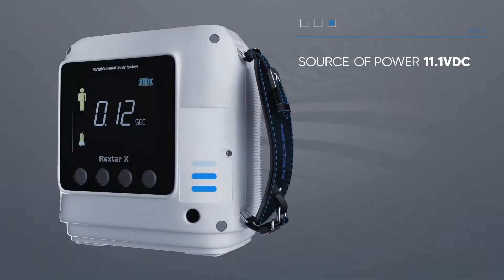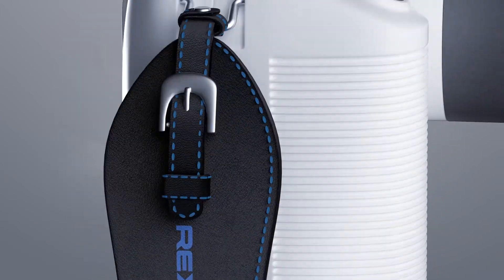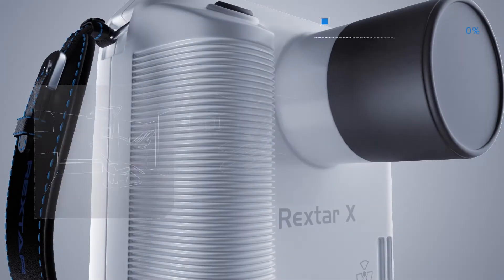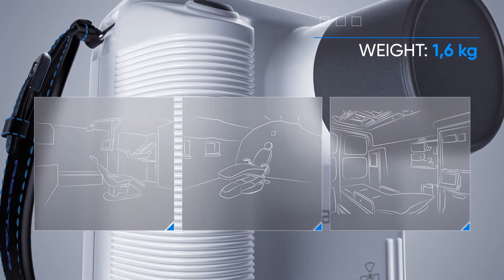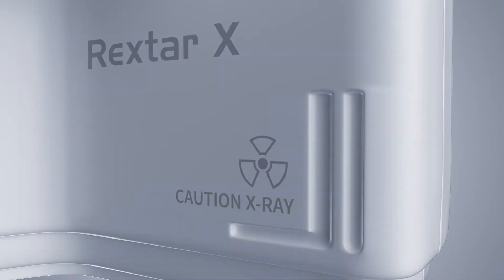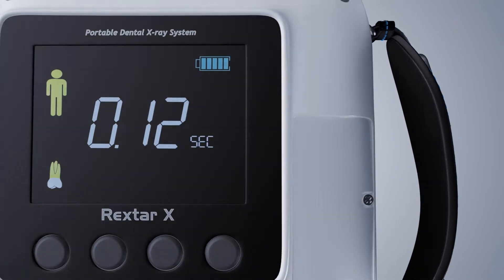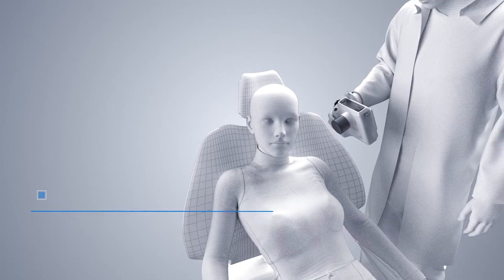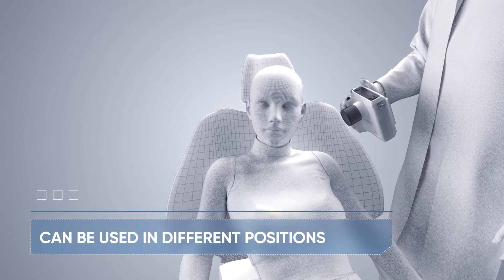One full battery charge is enough for 300 pictures. The Rextar X is so light that it can be held with one hand and used in different cabinets. There's no need to install and connect wires. The number of repeated snapshots is reduced, and quality control after completion of work is easy.